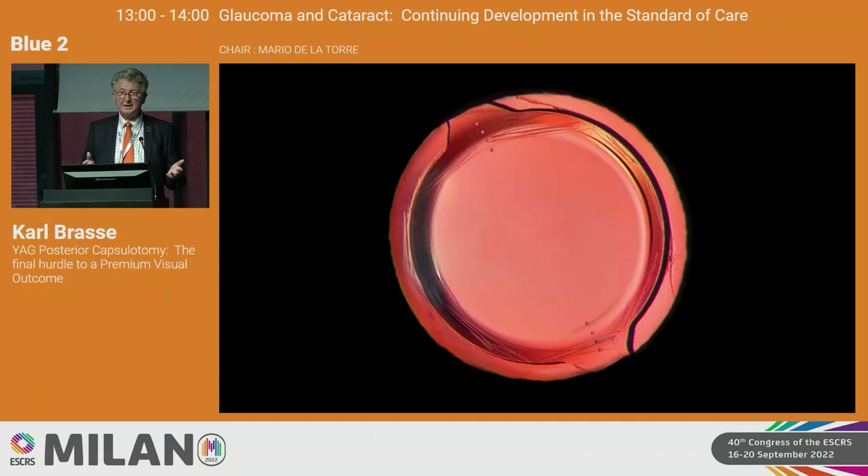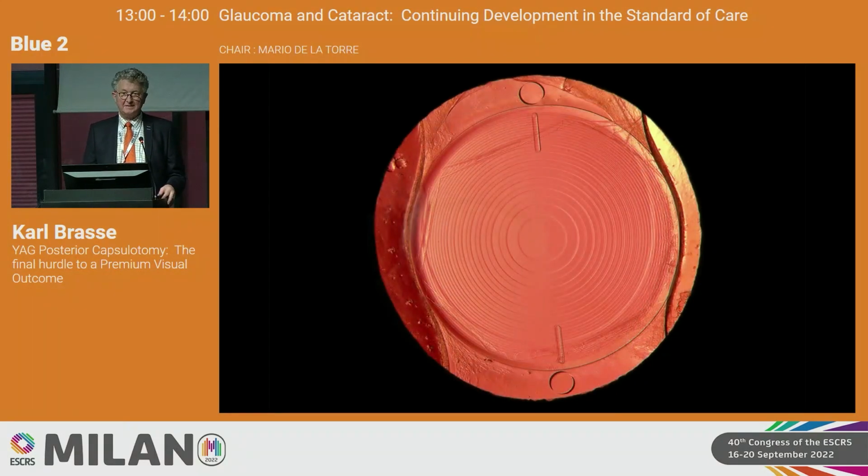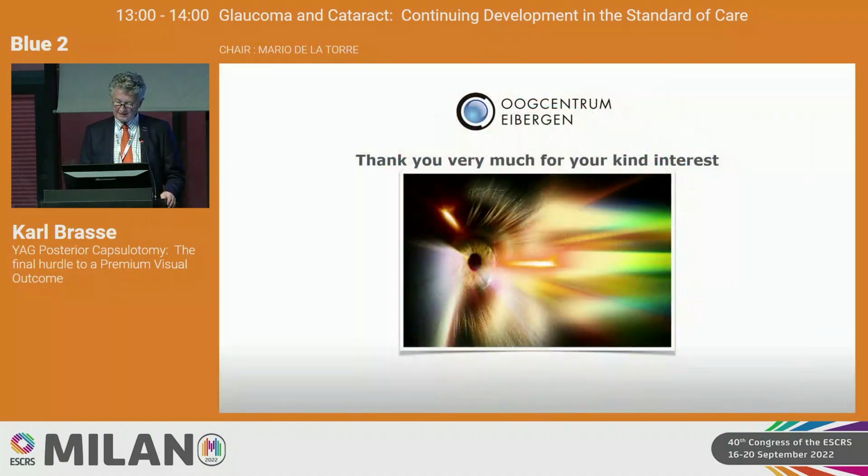And this is how they look in my practice usually when I do the case myself. And this is how, if you put in multifocal lenses, I'm not a fan of multifocal lenses, but if you put them in, I think the patient deserves it, that it looks like that. And it's easy. Thank you for your interest.